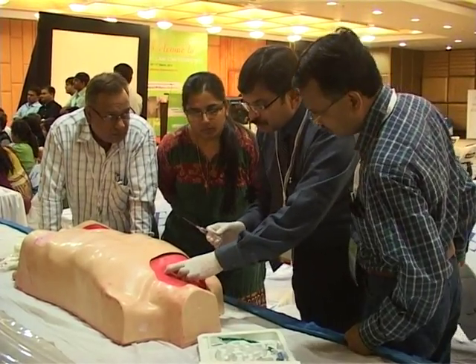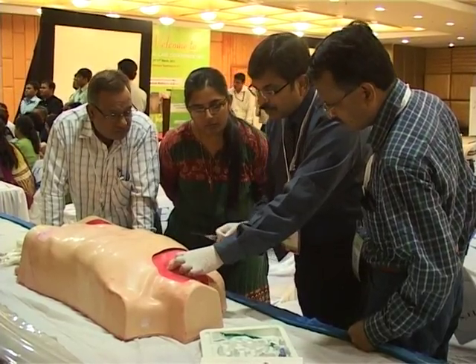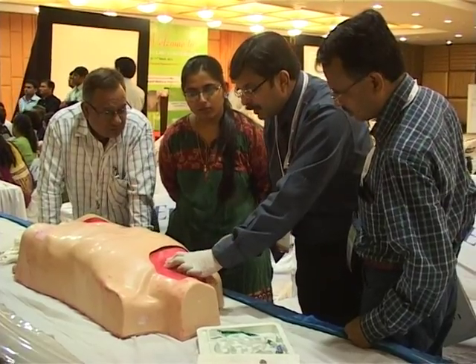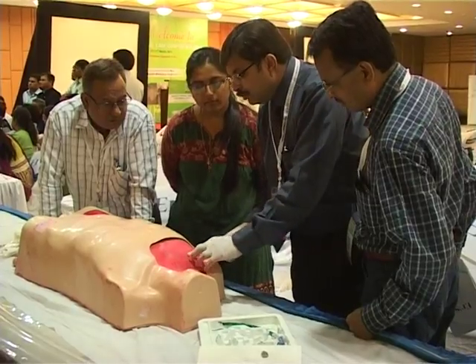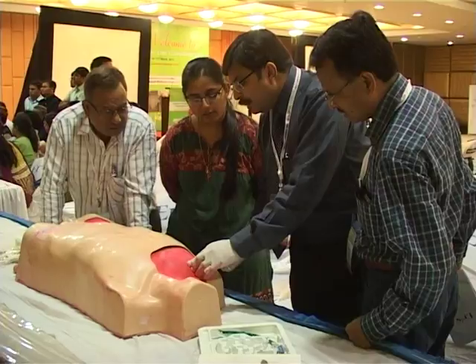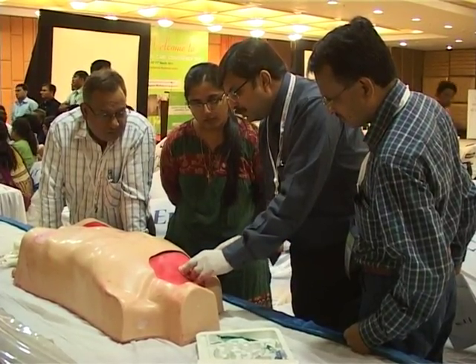I tell you, proper identification of the landmark is most important. Don't try to be in a hurry, and never put a line in a hurry or overconfident. You have to go just below the clavicle, and then divert towards the opposite shoulder.